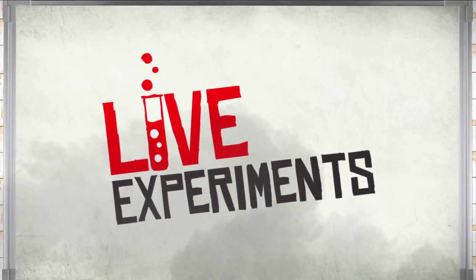Hi guys and welcome to the University of Bath. For this live experiment we're going to have a look at how fit, or indeed unfit, I am. We're going to be performing something known as a VO2 max test, which looks at how fit I am and how much oxygen I can get into my body. Elite athletes perform this regularly to fine-tune their training regime, but the average person can do it too.